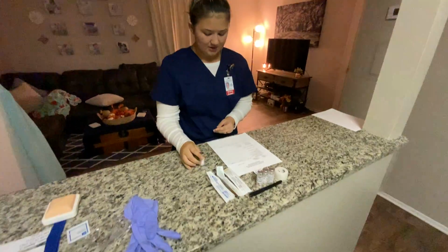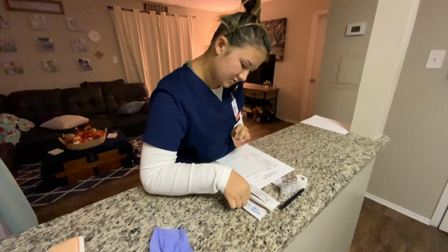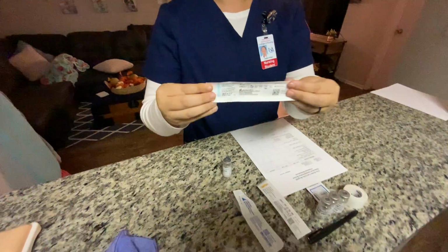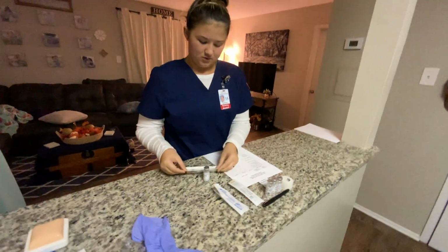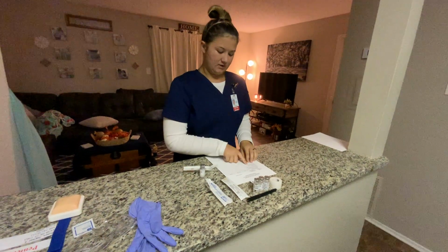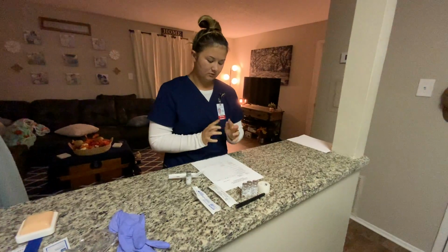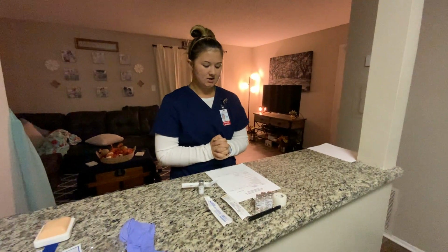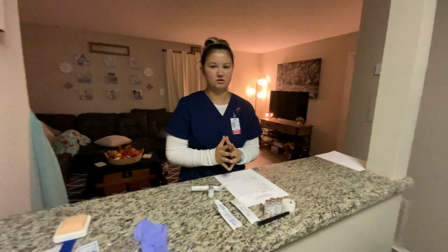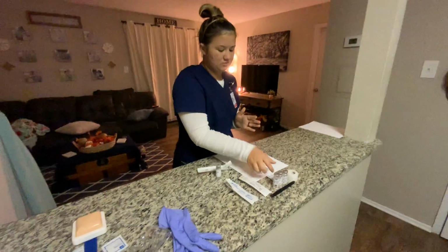And I'm going to be giving it subcutaneously, which means I'm going to be using a TB syringe and needle, which is this one. And then I'm going to be giving it every 12 hours, in which it has been 12 hours. And I'm going to note that the indication is that it's an anticoagulant medication, and I will document anything needed to be documented up until this point. So now I'm going to prepare my syringe.